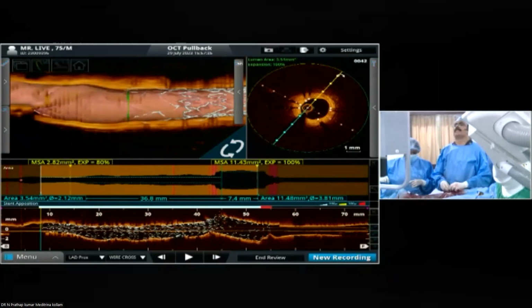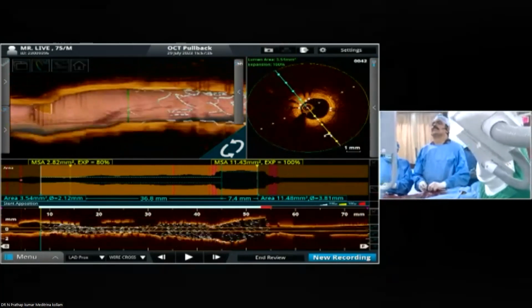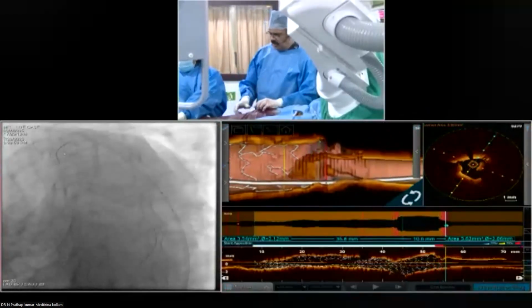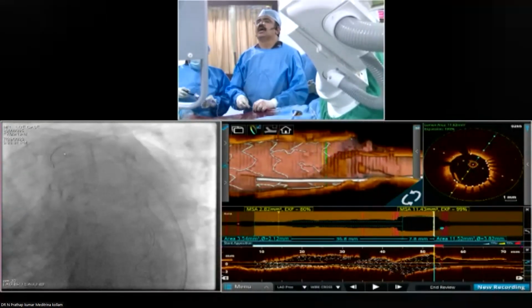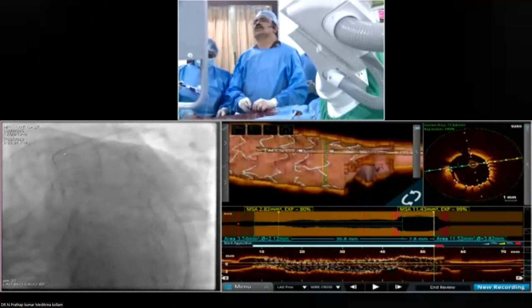Okay. Pratap, this patient has distal LMCA disease less than 3 millimeters, so near the ostium. Therefore, in this case alternative V stent can be used also. Of course, V stent and SKS are not the good techniques, and it is proven. These are all if there is no chance you can use, not the routine.